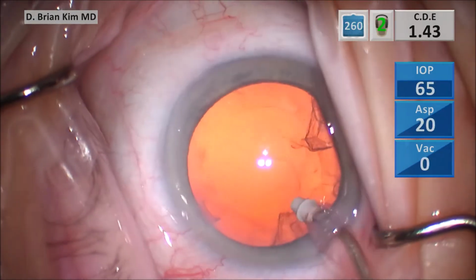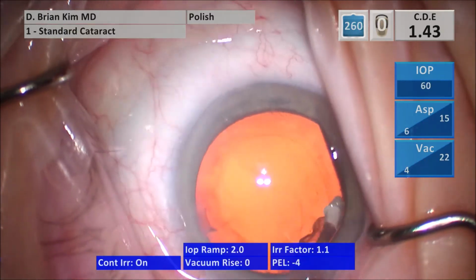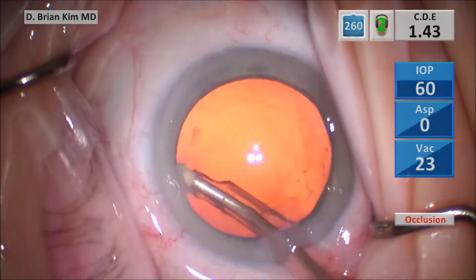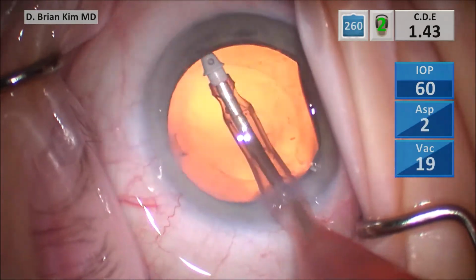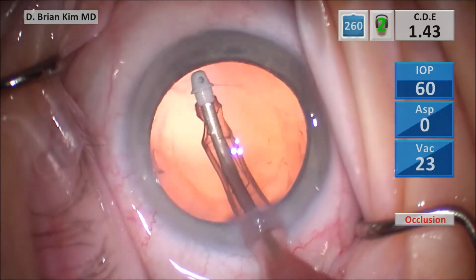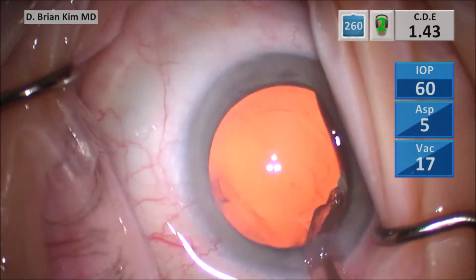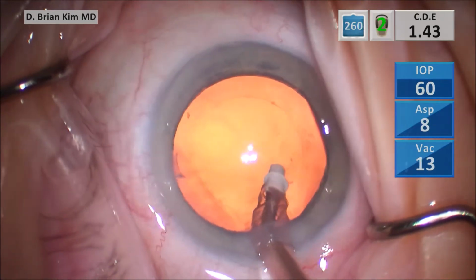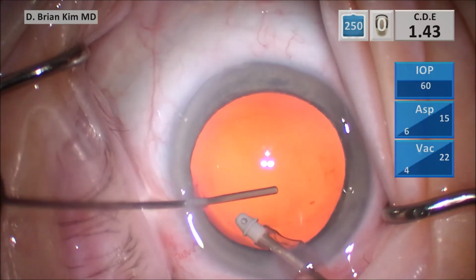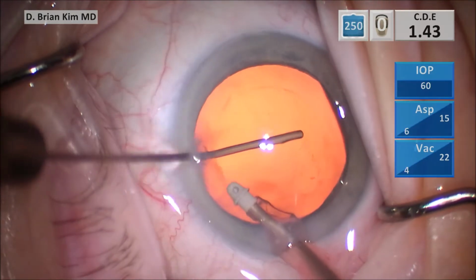Start sub-incisionally removing the cortical material. It's a fairly clean bag. Switch to polish mode, polishing under the rhexis edge, removing any remaining cortical material. So again, this patient had a pretty deep anterior chamber, kind of resisted the rotation of the lens pieces. I pulse into the subincisional space, looking for any remaining cortical material.